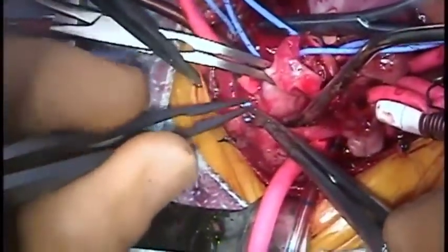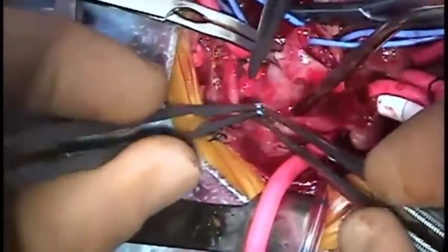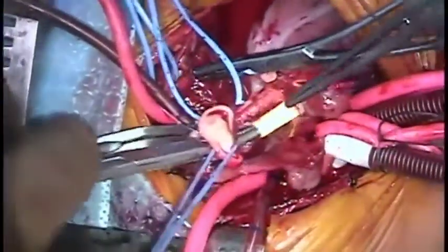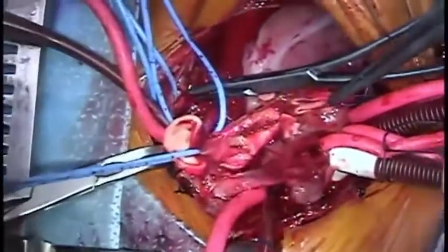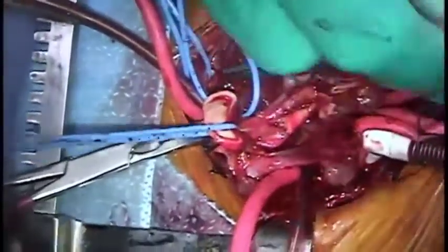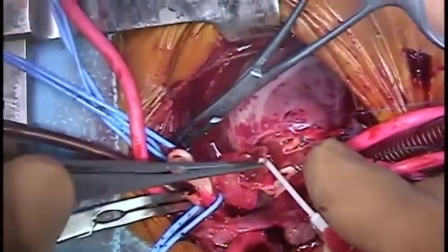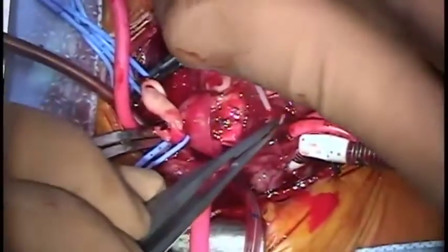Here we see the snares being removed from the head and neck vessels. The branch pulmonary arteries are reflected towards the head and the sutures from the aortic reconstruction are passed inferiorly. At the top of the screen we can see the clamp on the transected left subclavian artery. Cross clamp time is now over an hour, so further cardioplegia is given. Long cardioplegia intervals is a major advantage of the Del Nido solution.